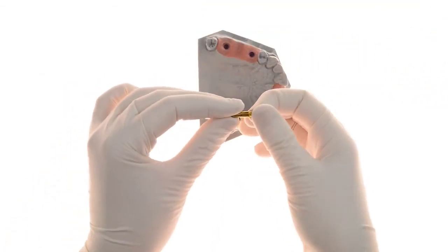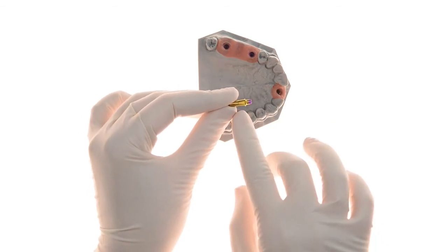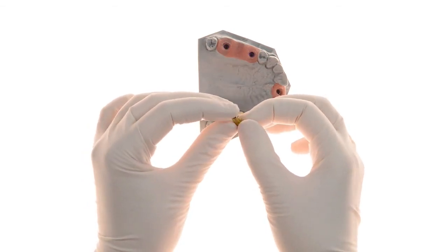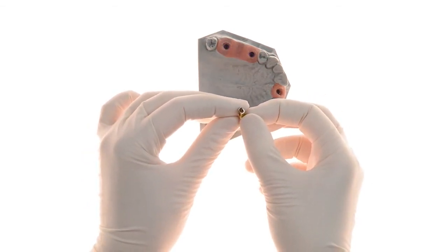For the adjustable EasyBase, the 10 mm pillar may be customized to the desired length. Here you can see the EasyBase post adjustment. Once customized, the adjustable EasyBase is directly scanned.